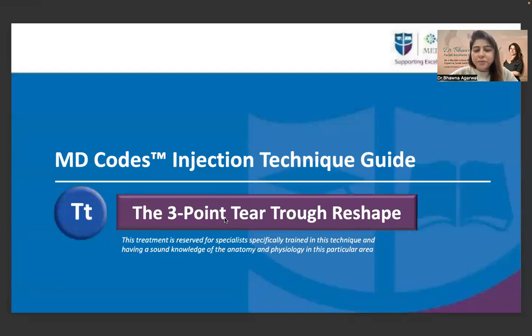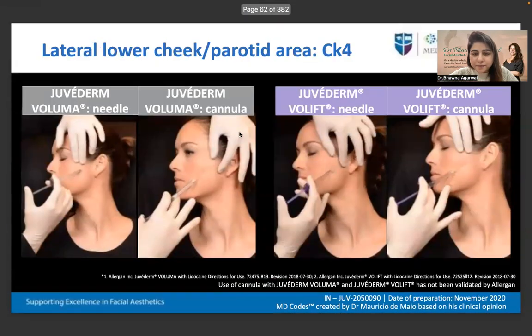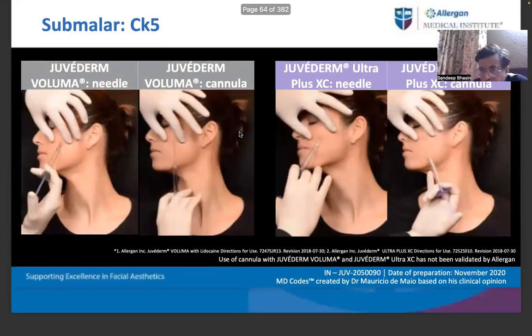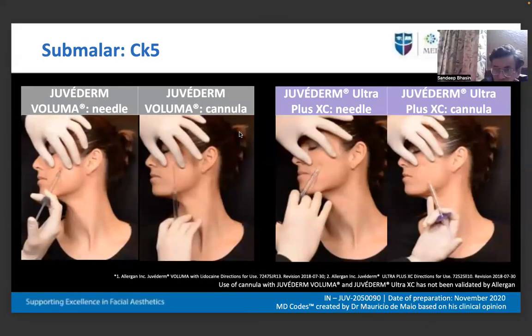So this was all about CK5. Next session, we'll be doing the 3-point tear trough reshape. Any questions regarding this? I've been using these points quite often. In fact, I've been using CK1, CK2, CK3 quite a lot, because that's where the maximum of my filler work is. But add CK4 also for senior age groups and heavy faces. It will give very good definition to the jawline. Just as to give a good result in tear trough, CK1 should be addressed first, similarly for a good jawline, CK4 should be addressed.